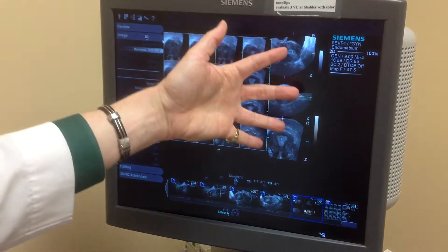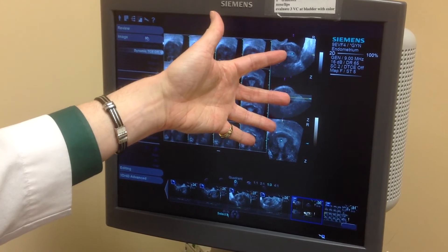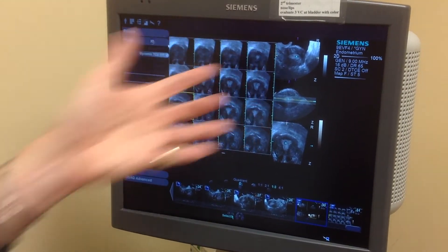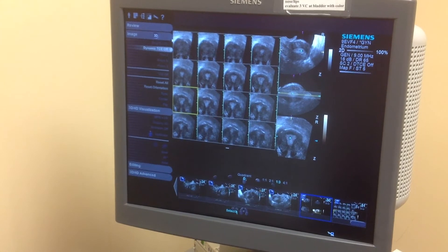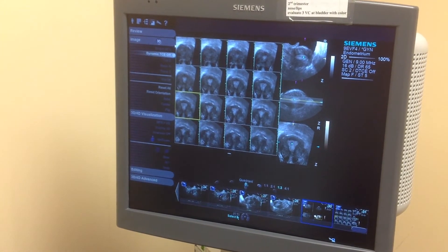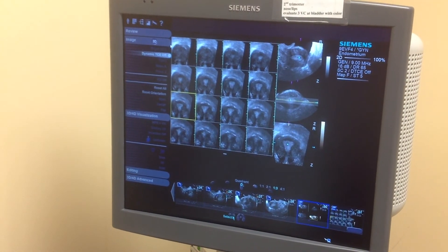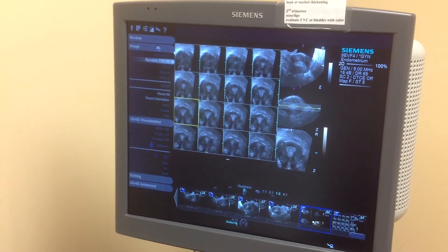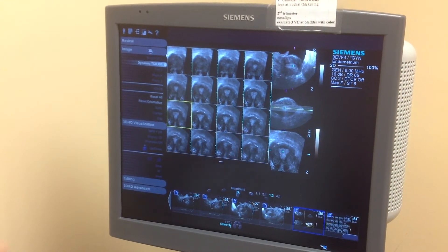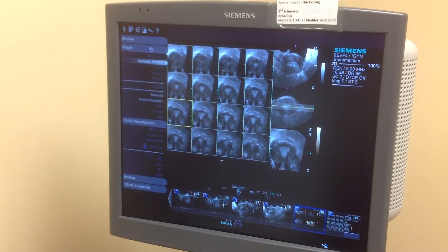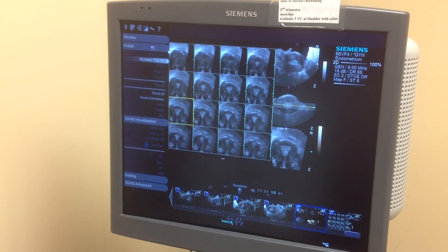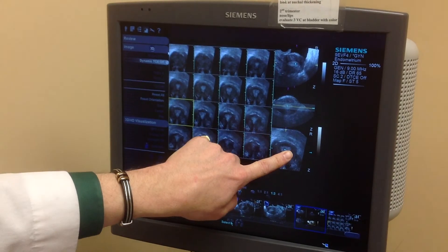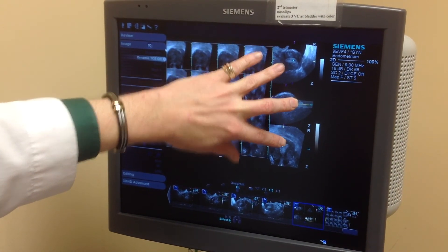So this is 3D multi-planar reconstruction. What you see with baby faces is a surface rendering of the actual surface, and the reason we see that surface nicely is because of the fluid surrounding it. If you don't have any fluid surrounding it, you're not going to see the baby's face. And if you slice down into the baby's head, you're going to see images more similar to these 3D side images.